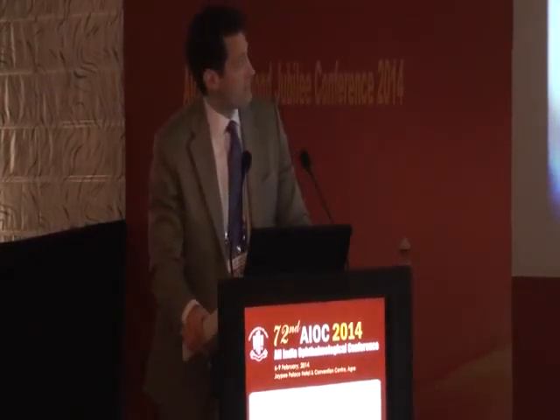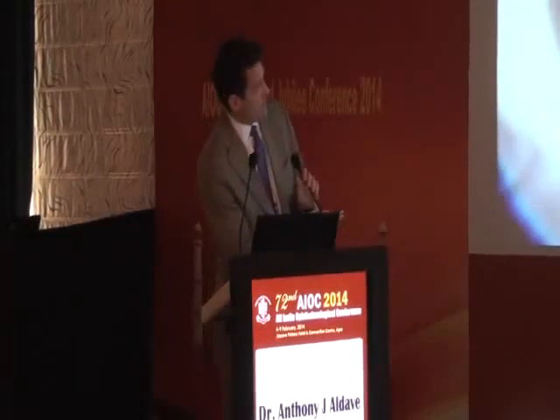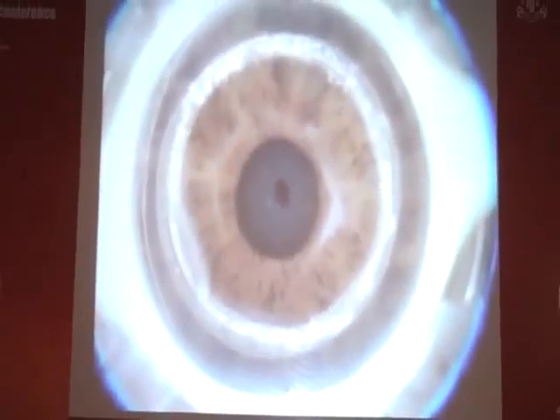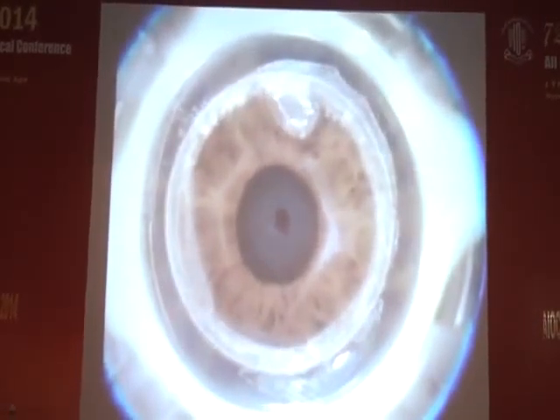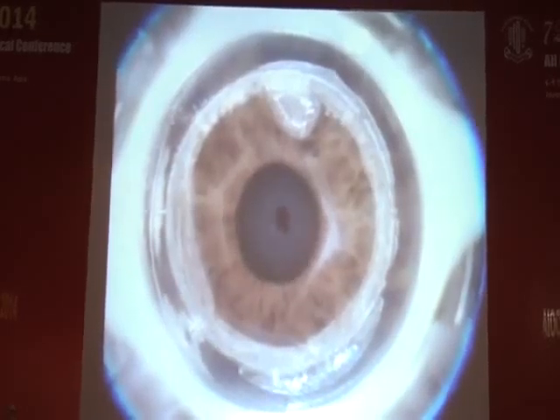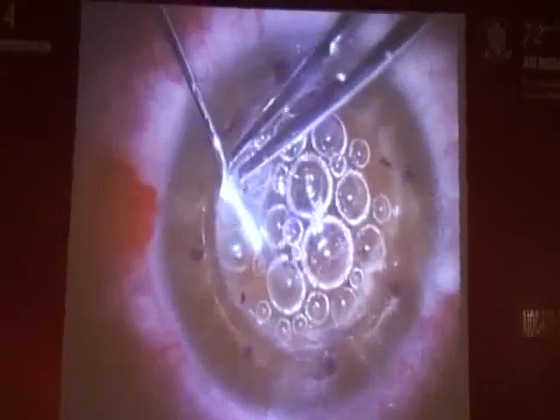For those of you who have not seen the femtosecond laser and its use for keratoplasty, this is a patient of mine who had previous hexagonal keratotomy, an older treatment for hyperopia. We see here this is the zigzag edge profile, so it starts with a posterior side cut, starts posteriorly, then moves anteriorly, ring lamellar cut, and then this anterior side cut. And you see where the air bubble now is broken through, cutting into the glass, and then the creation of these radial alignment marks. You can make anywhere from 4 to 12 of those to help with tissue distribution.